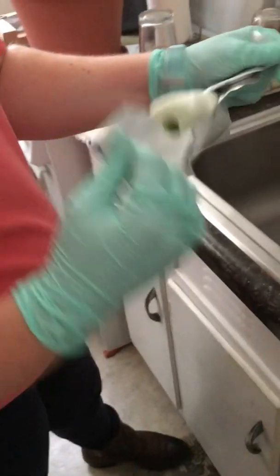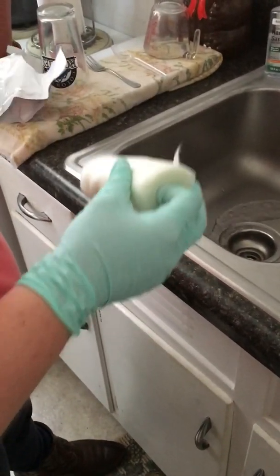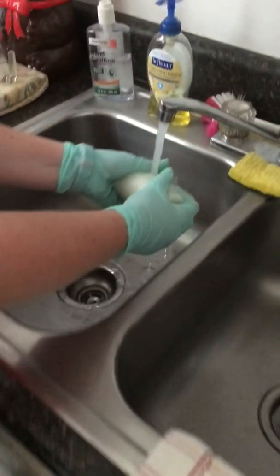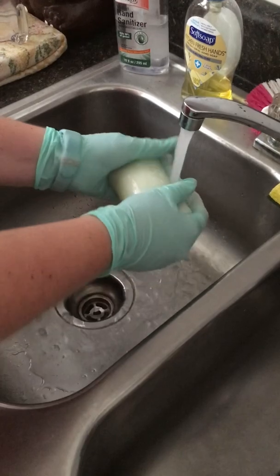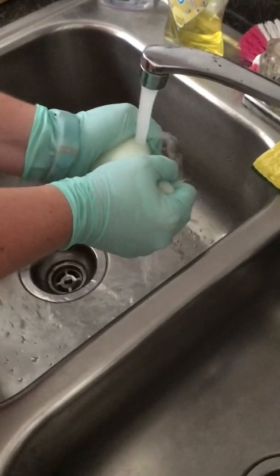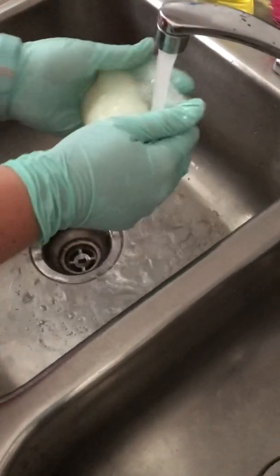The first thing that you're going to want to do is run your casting material under warm water. You can choose cold water if you prefer having more work time, but you want to make sure that you get the water all the way through to the middle of your casting material. A good easy way to do that is to just squeeze your casting material once under the stream of the water, and that will make sure you push the water all the way through to the middle, and then squeeze it once more outside of the water stream.